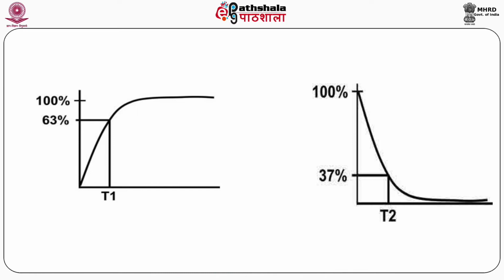That means relaxation is the recovery of protons back towards the equilibrium position after being disturbed by RF excitation. When the RF pulse is switched off, transverse magnetization is reduced, which is called transverse relaxation, the decay of transverse magnetization, while longitudinal magnetization increases, which is called longitudinal relaxation.